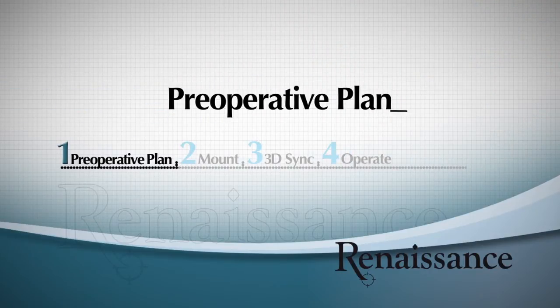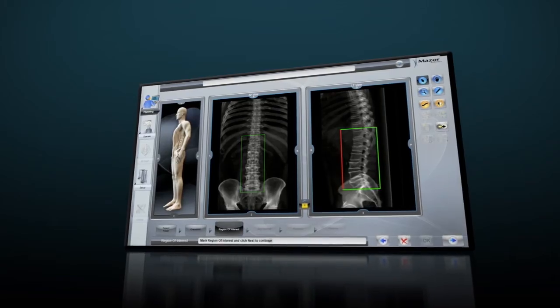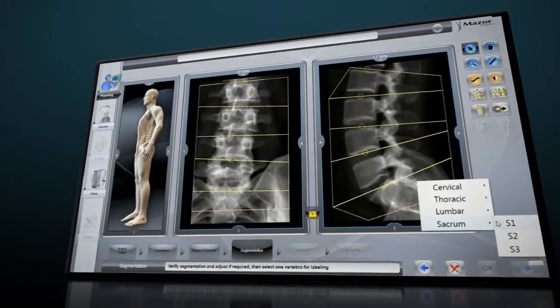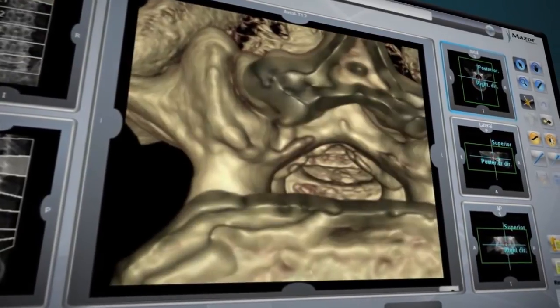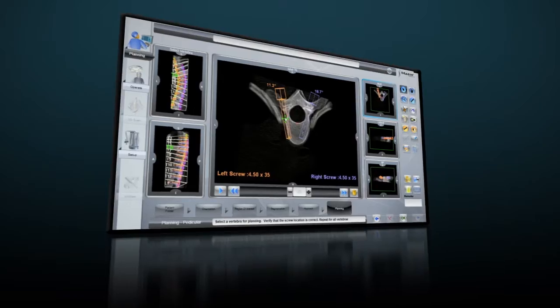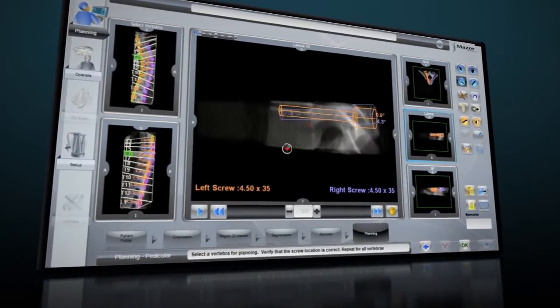The first step of a Renaissance procedure starts before entering the operating room with preoperative planning on a computer. The patient's CT scan is uploaded to Renaissance's advanced software to create a detailed 3D model of the patient's spine. This enables you to accurately visualize the patient's spinal condition and plan the ideal customized surgery in a virtual 3D environment.